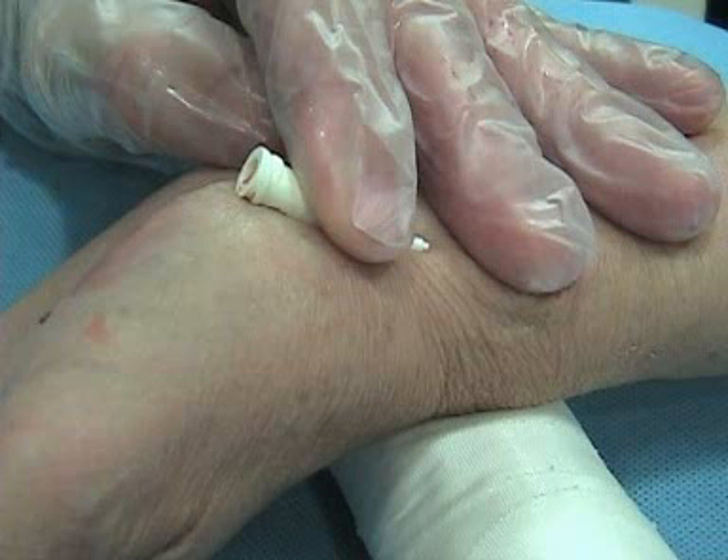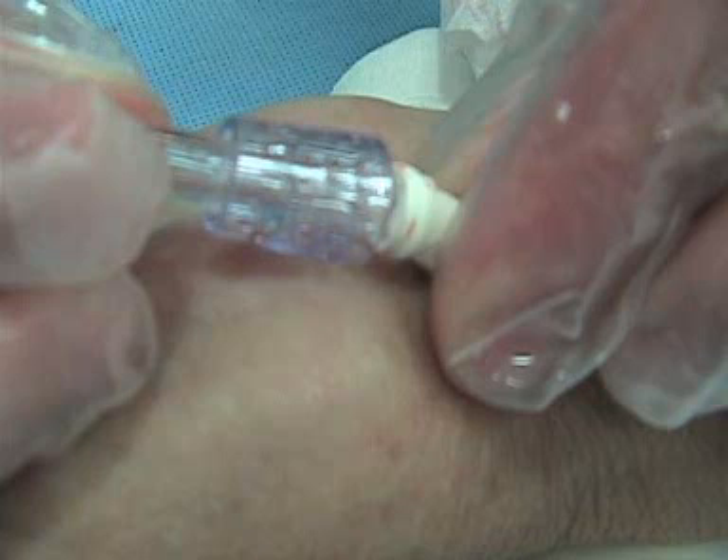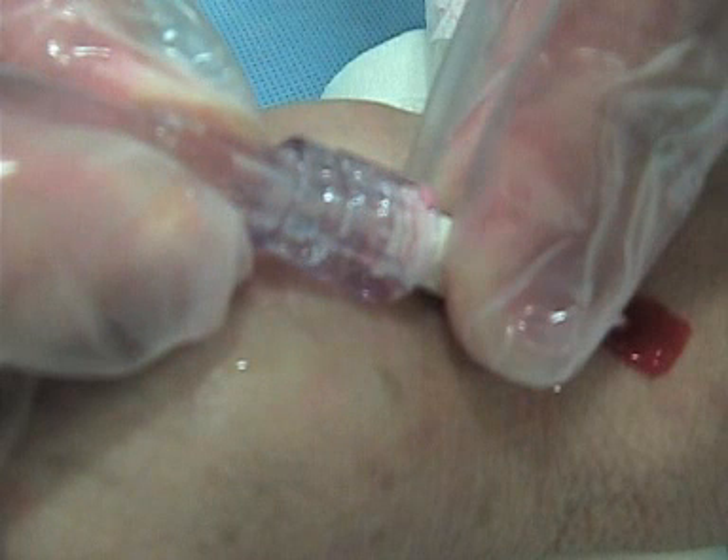As you withdraw the needle, blood will spurt out, so you want to reach up — you can see my fingers holding here — to keep blood from spurting out. I lost a point or two because a little bit of blood came out. Now it's time to hook up; notice this is a luer lock connection, because if an art line disconnects the patient can bleed out. Make sure you snug it up tight — a non-luer lock connection that pops out will put you in big trouble.